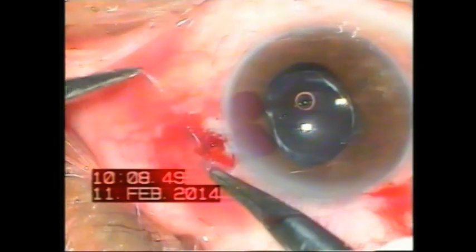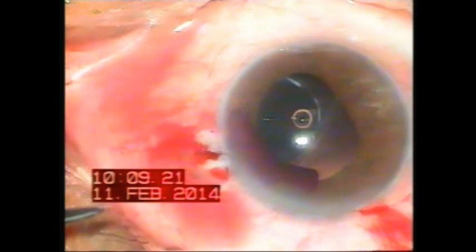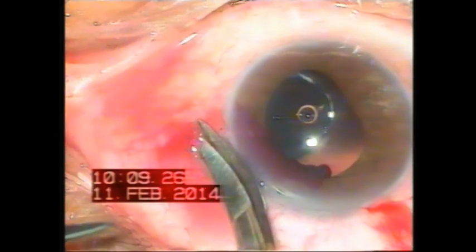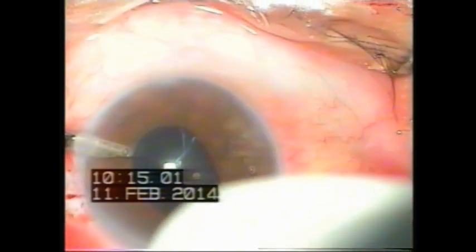Haptic bag complex was dialed in position at ciliary sulcus by applying gentle traction on the sutures. The fixation suture ends were tied to each other and cut ends buried inside the scleral tunnel. Anterior core vitrectomy was performed.